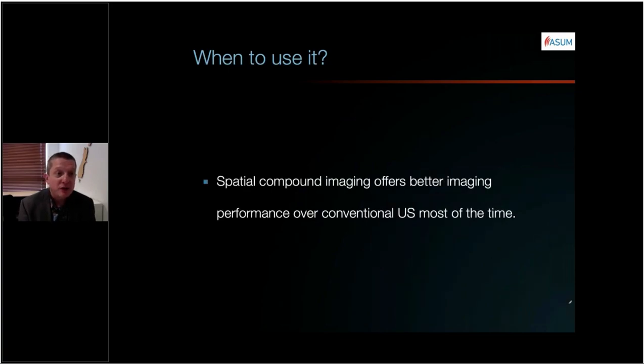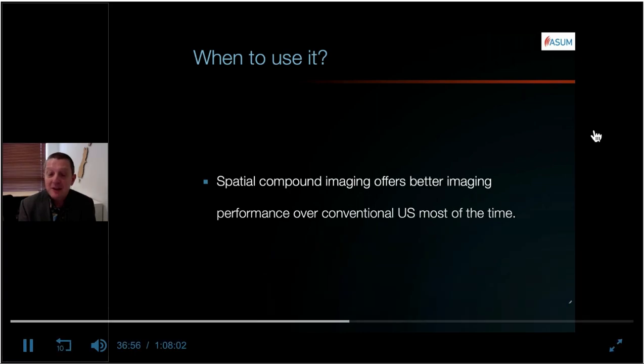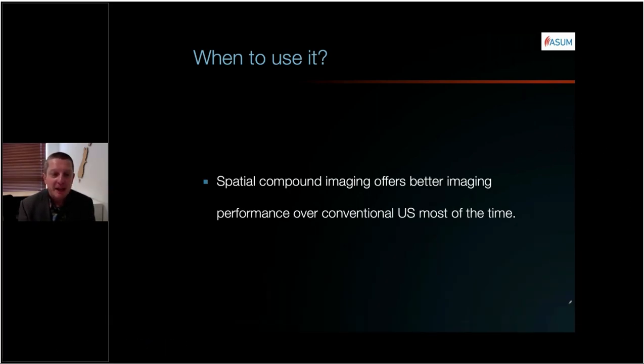So finally, when should spatial compounding be used? Well, spatial compound imaging offers better imaging performance over conventional ultrasound most of the time. So much like tissue harmonic imaging, you'll find that it is a component of most of your standard presets.